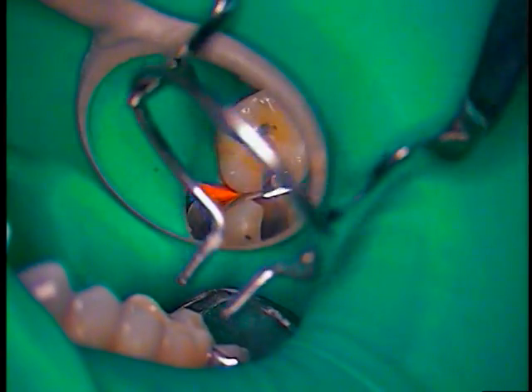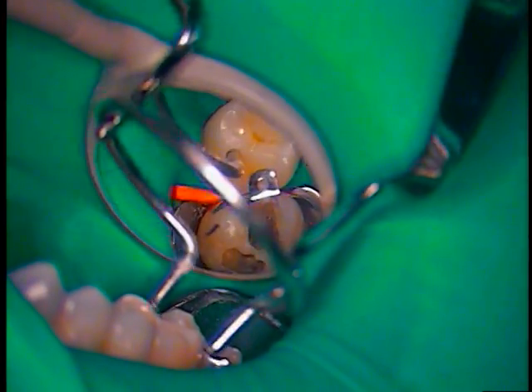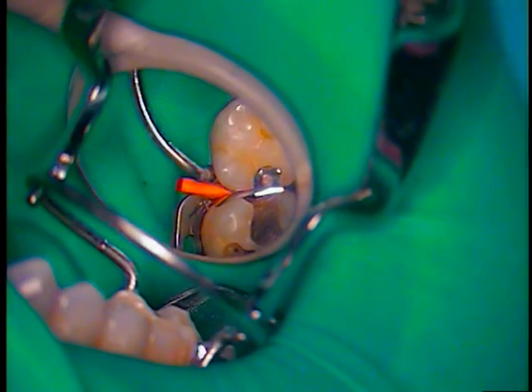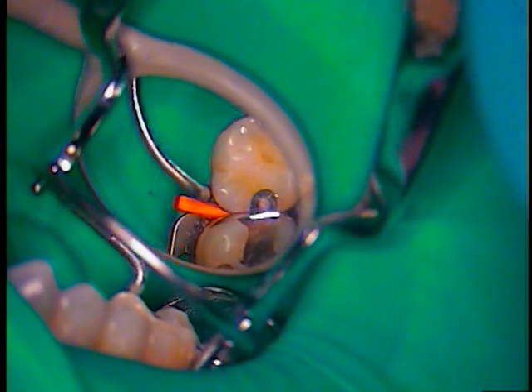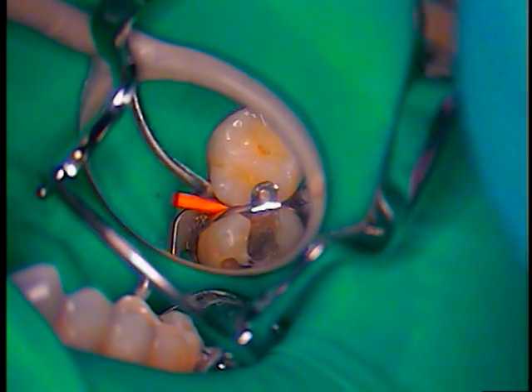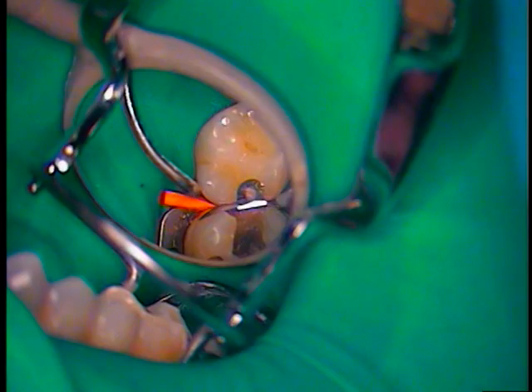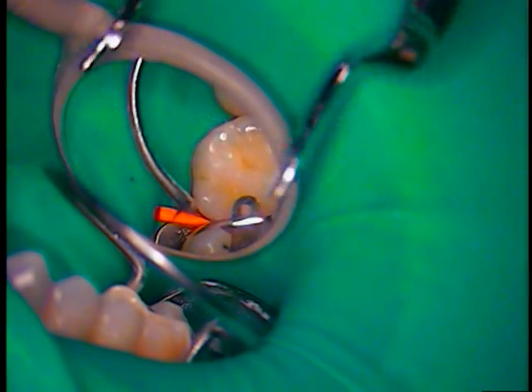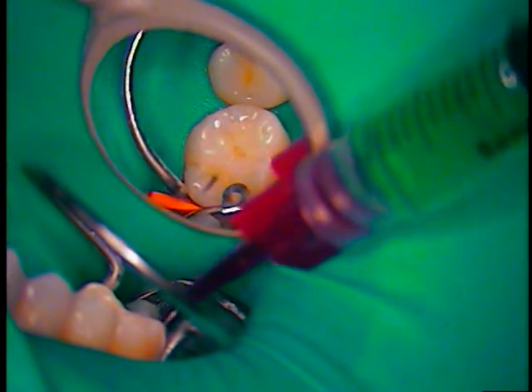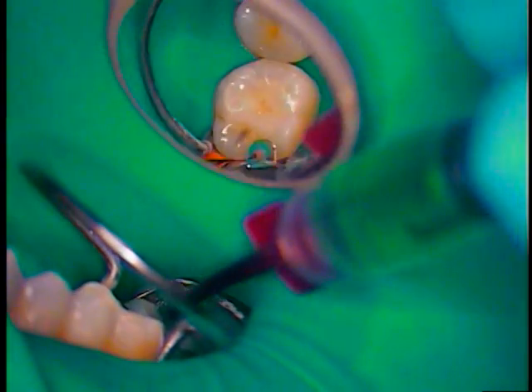The tine. Now I'd like to place this since my lingual is really well done, I'm gonna just go right behind the wedge and let that compress.